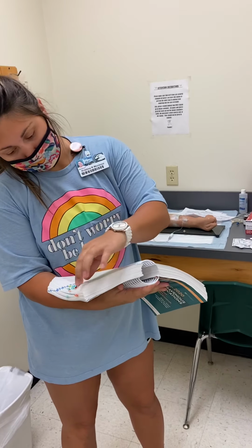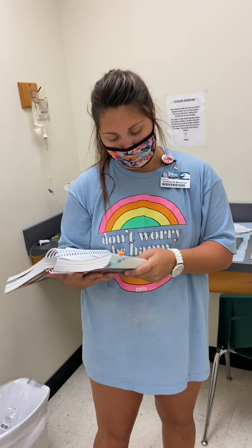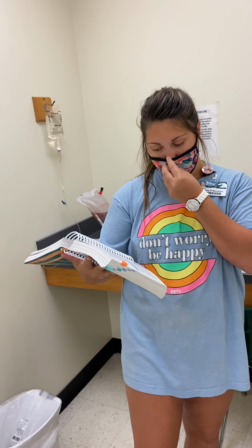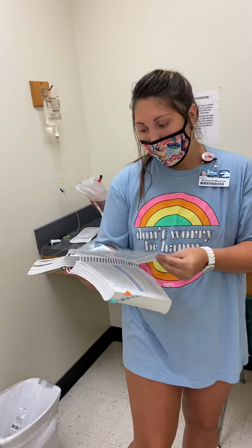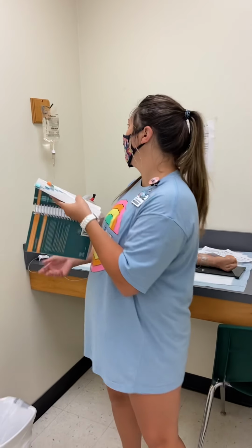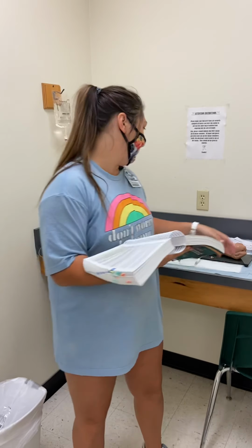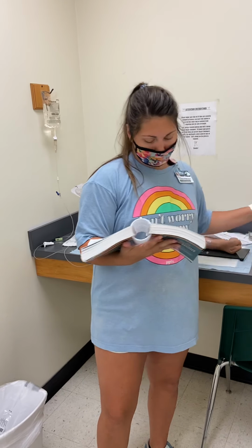I'm gonna go ahead and do the gentamicin, and it's a safe dose. It's 3 milligrams per kilogram of body weight, 24 hours, equally divided into 3 doses. It can be given in 50 to 200 milliliters of IV normal saline or D5W. D5W is hanging, so it's compatible. And then it's mixed in normal saline. It says you can give it over 30 to 60 minutes. I'm gonna do an hour just to be on the safe side.